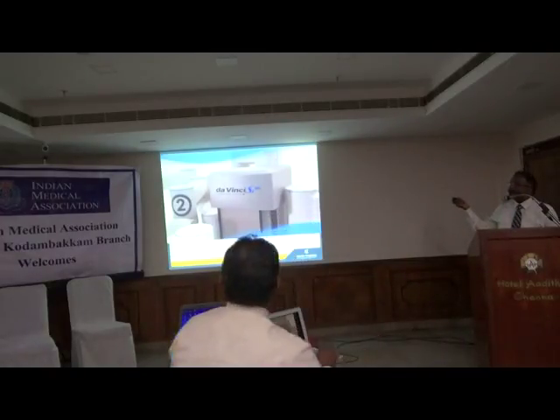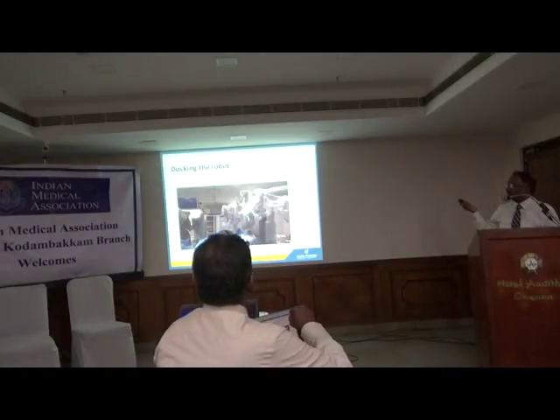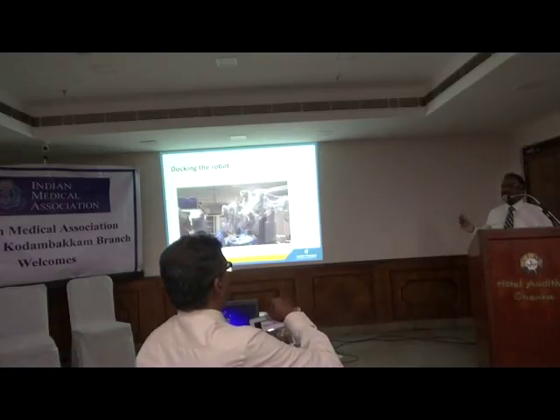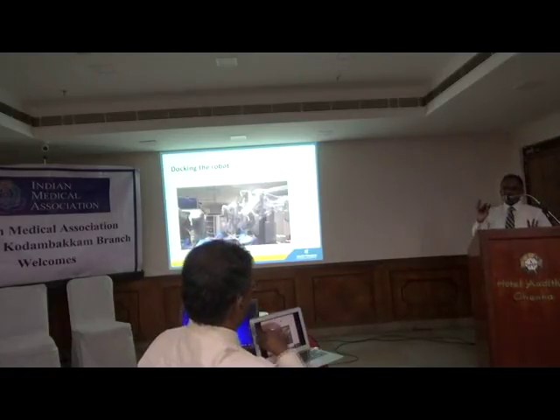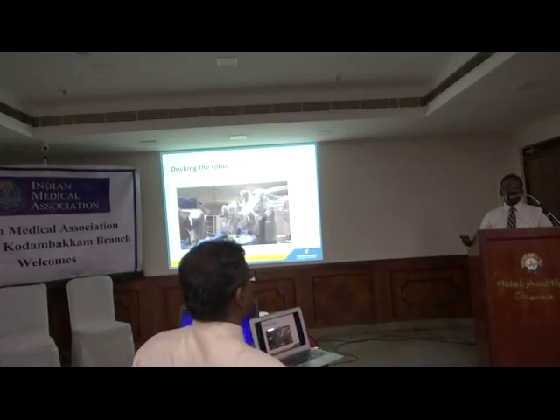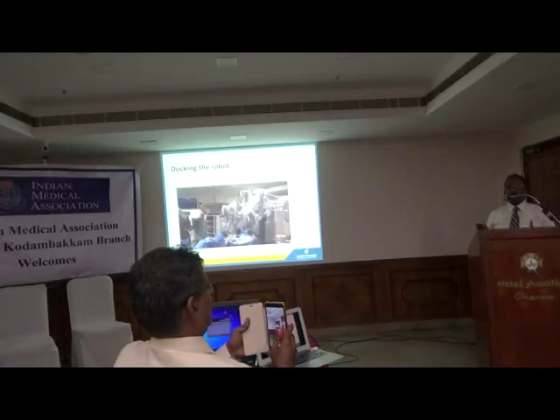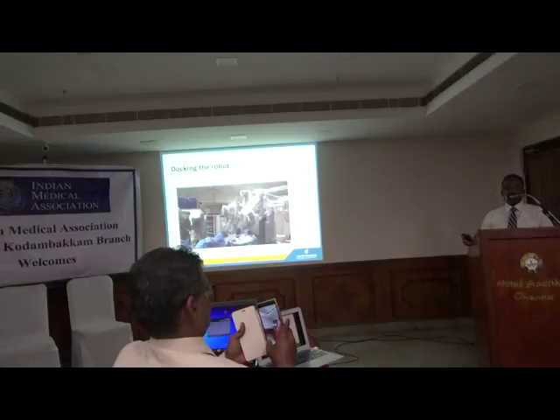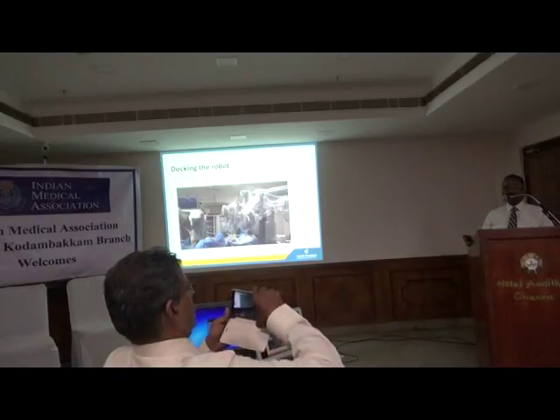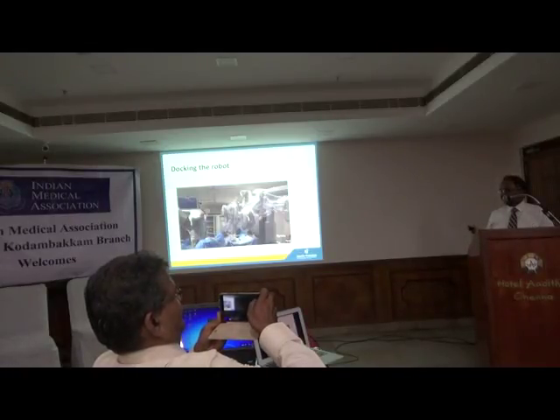This is an SI machine, and now we have the latest one. I think this is the machine, how it is docked. So basically, what we do in a robotic is, instead of the surgeon holding the laparoscopic instrument, the robot is holding the instrument, and the movement is completely controlled by the surgeon's arm. So it's like playing a video game. At the same time, the surgeon has control of the camera. So you don't have to shout at the assistant, hold that camera, show me here, show me that. No, it's entirely under your control.